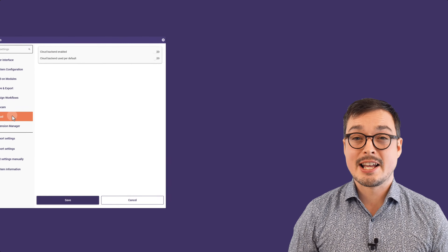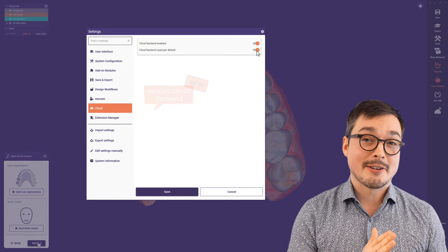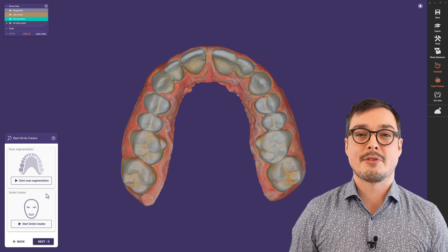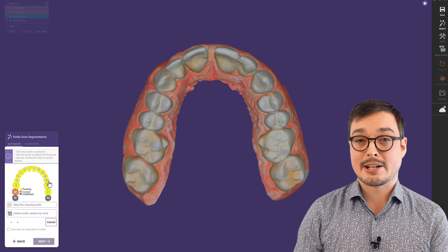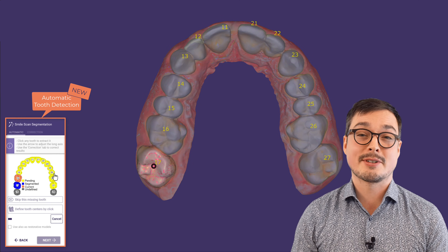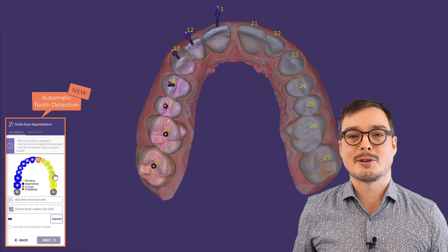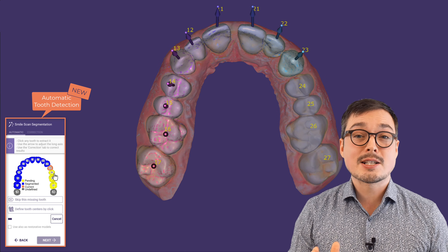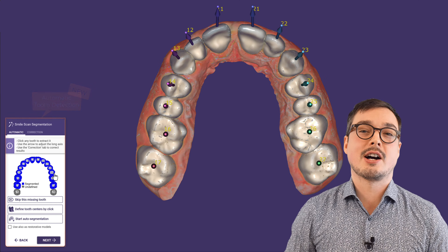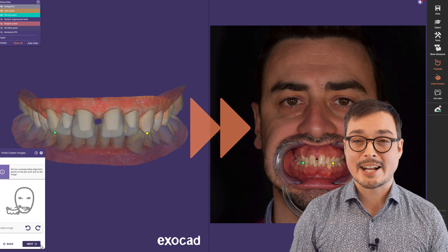DentalCAD 3.2 Elfcina introduced the Exocad cloud. If activated, calculations, data processing, and even AI calculations can be performed there. Automatic tooth detection is our first feature using this opportunity, as part of the new multi-tooth segmentation. With 3.2, it's available in a variety of workflows like SmileCreator, BiteSplint, and DuplicateDenture. More features will follow over time, so stay tuned.